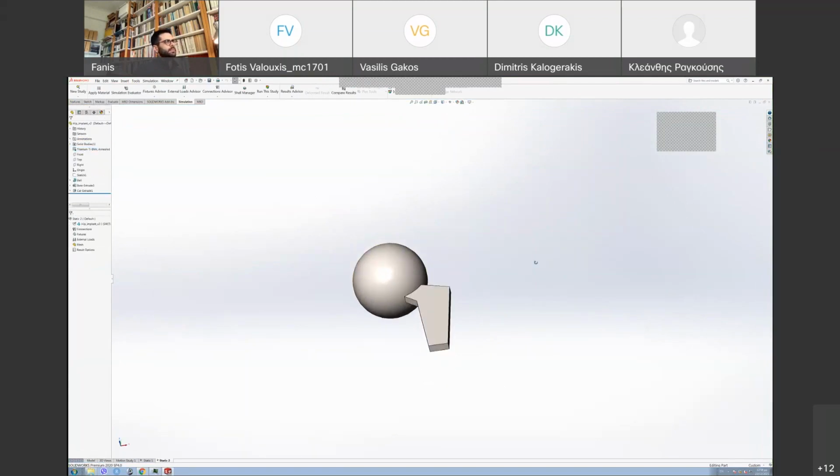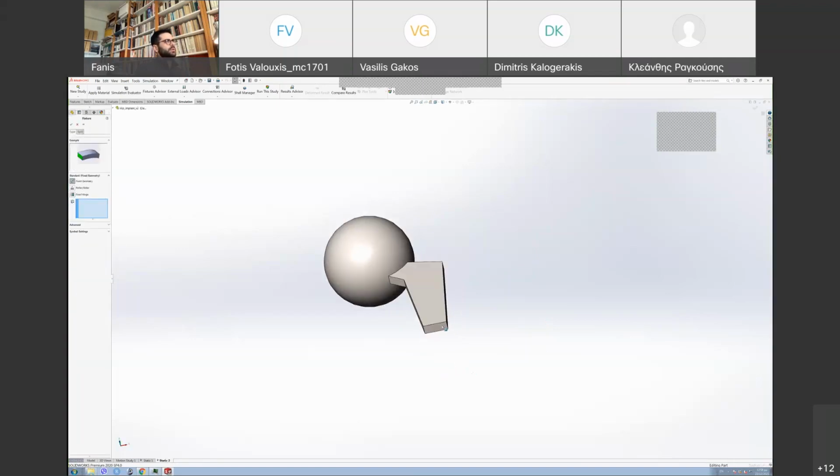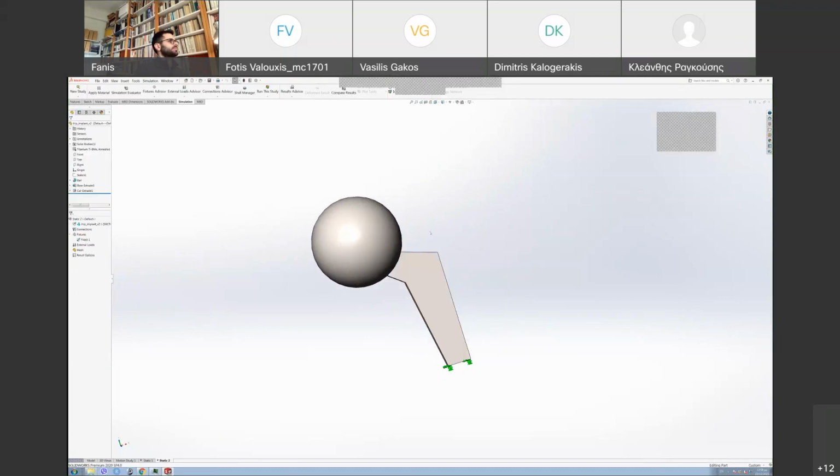So this is okay. Now what you're gonna do first is add fixtures, because this needs to be stabilized somehow. So it's fixed geometry. You go here, you select the surface. Okay. Fixed geometry is πάκτος στα ελληνικά. Okay, it can't move. Okay, essentially. So this is okay. This is the constraint we have, because when you're performing a finite element analysis, you need to have a constraint and you need force or something else.